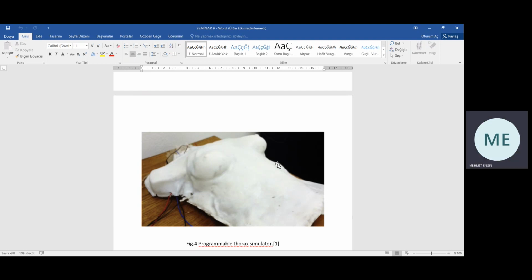Now, design and construction of the transducer. Electrical actuators are essential elements for physical simulation of breast injuries. The actuator design requires features similar to tumor masses, with round shape and size between 6 and 12 millimeters. Electrical resistors were used to produce heat radiation. To sense the temperature values generated by the resistors, LM35 temperature sensors were used.